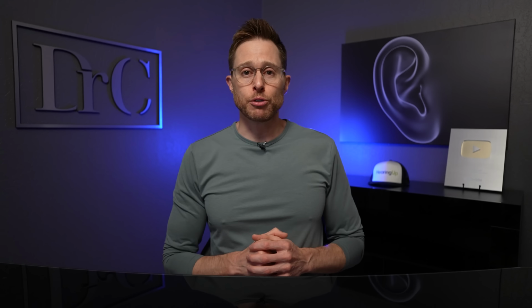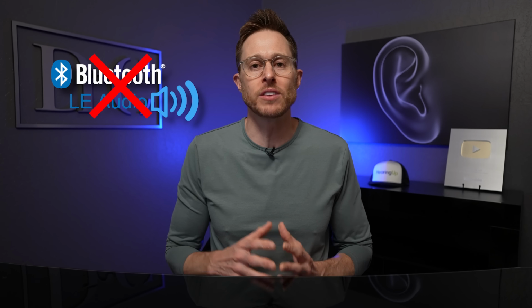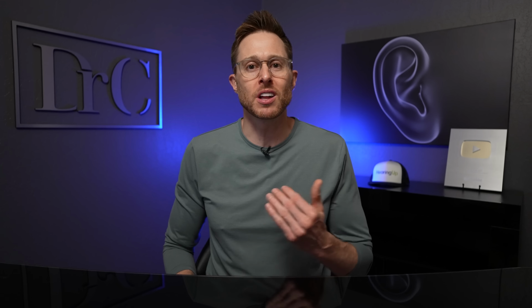Okay, let's talk about Bluetooth here. So a lot of individuals were really hoping that these hearing aids were going to come out with LE audio Bluetooth, and unfortunately Phonak has decided to go a different direction. Right now they are only compatible with Bluetooth Classic devices. Now, this is not all bad news.